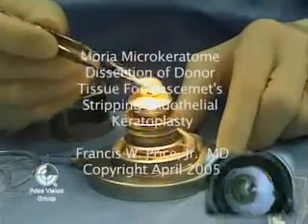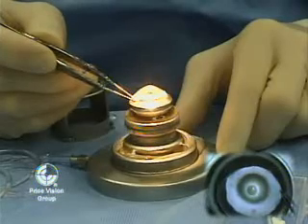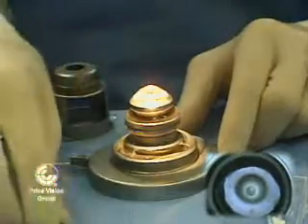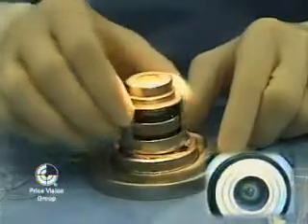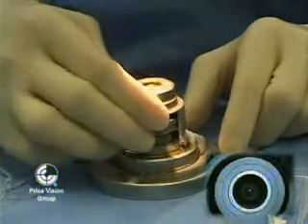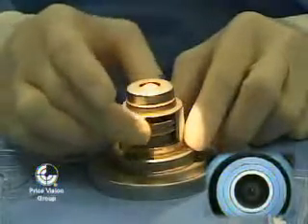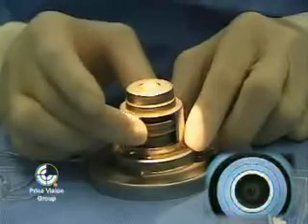The Moria artificial anterior chamber is really an elegant way to prepare the donor for posterior grafting procedures. What we're doing here is we have an infusion of balanced salt solution hooked up to the bottom of the Moria artificial anterior chamber. And we have it turned on when we place the tissue on the top of it, but then we turn it off once the air bubbles out from underneath the corneal tissue.